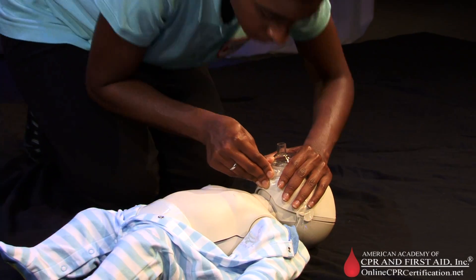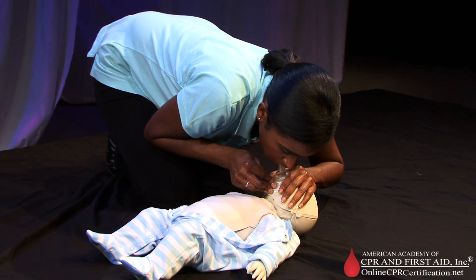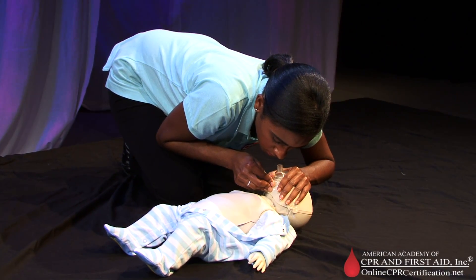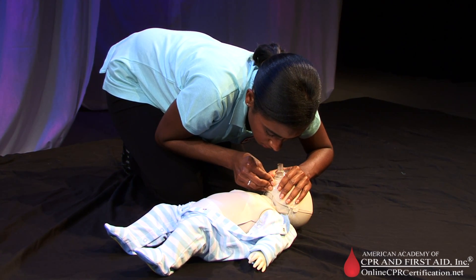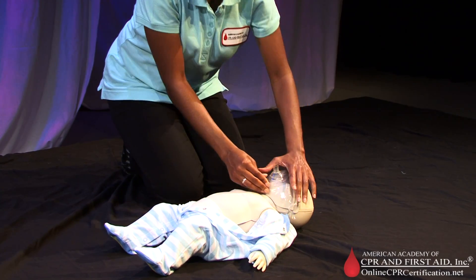Give two breaths. Deliver air over one second to make the victim's chest rise. Give one breath every three to five seconds — twelve to twenty breaths per minute.